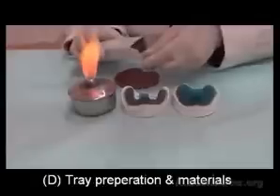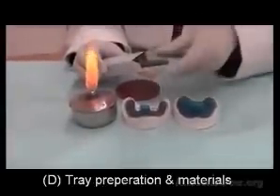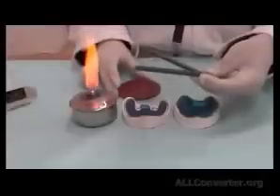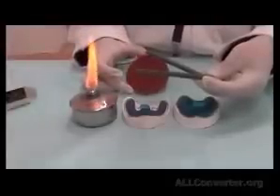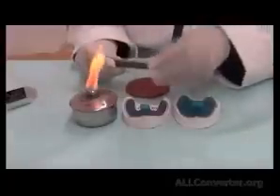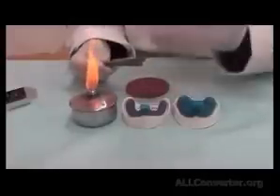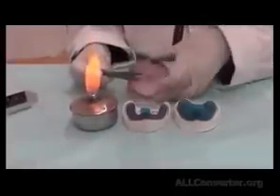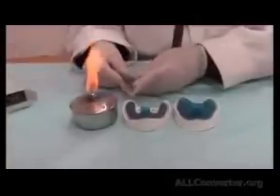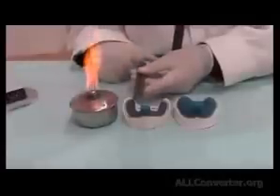For the border molding step in the clinic, you will have from the dispensary what we call a green stick material. Green stick is a type of compound. It's similar to the compound you had earlier in the primary impression. But this is a low fusing, meaning that at a lower temperature it will fuse and it will become pliable at lower temperatures, so it's easier to manipulate than this type. This has more filler in it. So it's called the green stick. It's a type of impression compound. It has wax in it, and it has fillers, and it has, of course, the color which is produced, which is green.